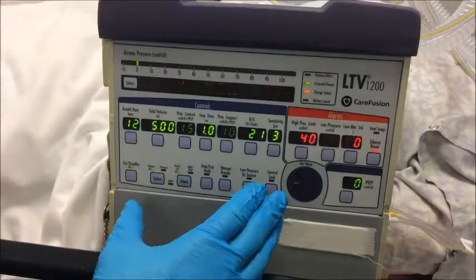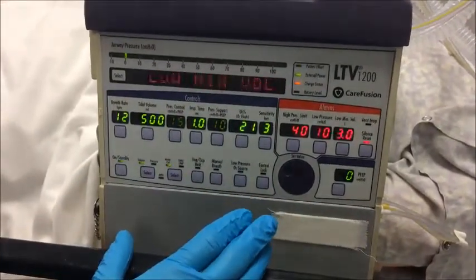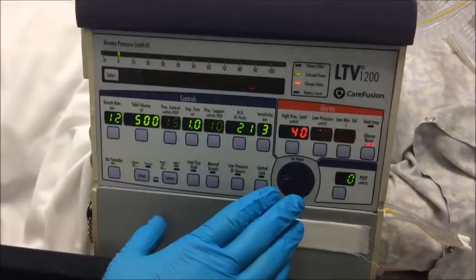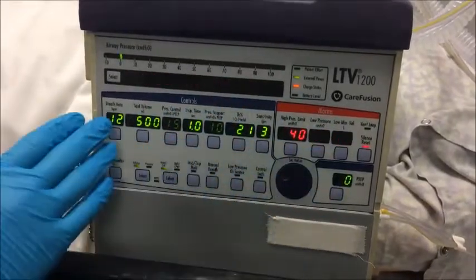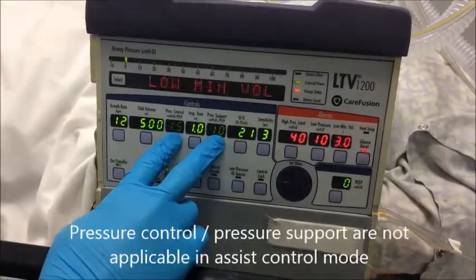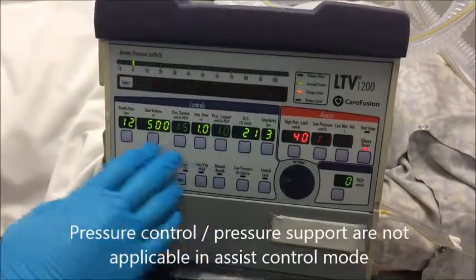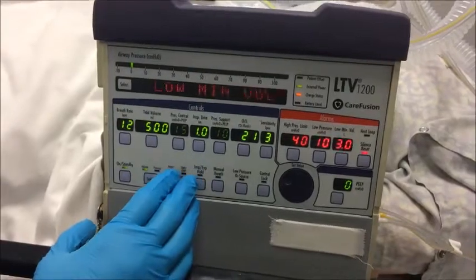After that occurs, it starts into a live mode. At this point, we're not quite ready to connect to the patient. A few features to note when you set this up. All of the illuminated values are the live values. You see some that are dimmed out. Those are for other modes. In this case, we want to start and make sure our settings are appropriate to our patient.